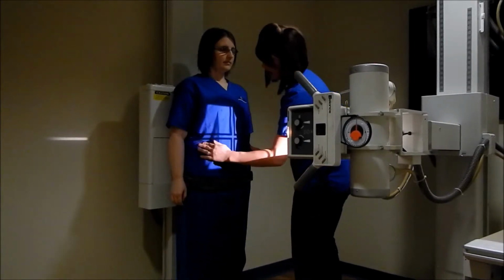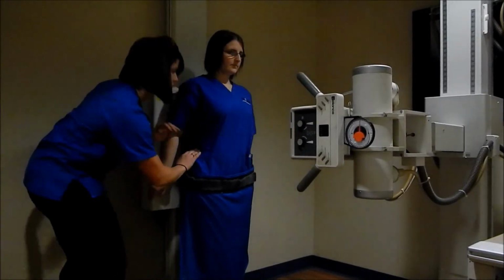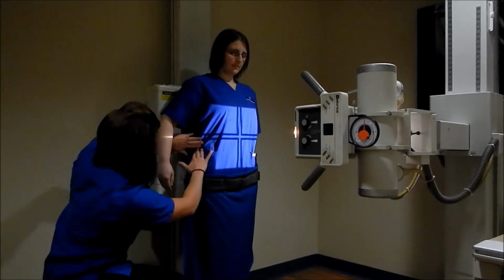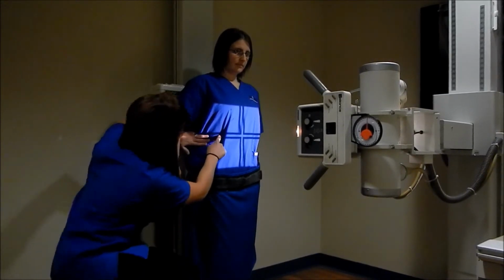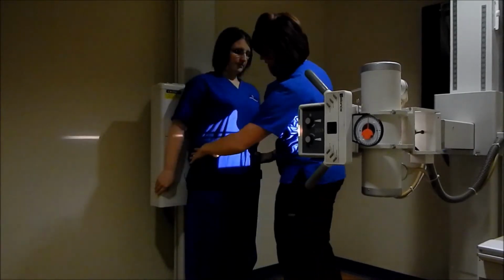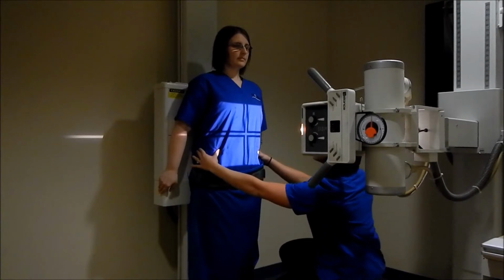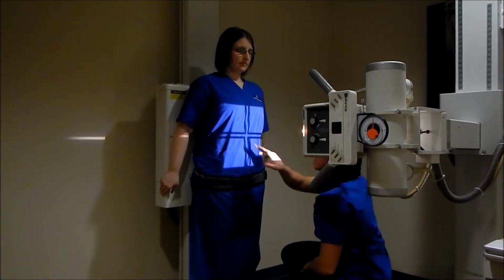You're going to feel again for that iliac crest, and then go about 2 inches above, so that's right about there. And then make sure, again, ASISs are equidistant to the bucky, and you can feel for mid-sagittal.